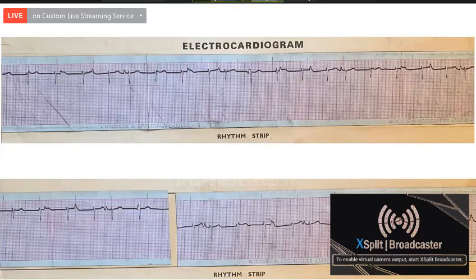Okay, this is a slightly more difficult electrocardiogram. This is an arrhythmia, not a usual arrhythmia, an unusual arrhythmia. Any volunteers to discuss? I will help you. This is a monitoring lead.